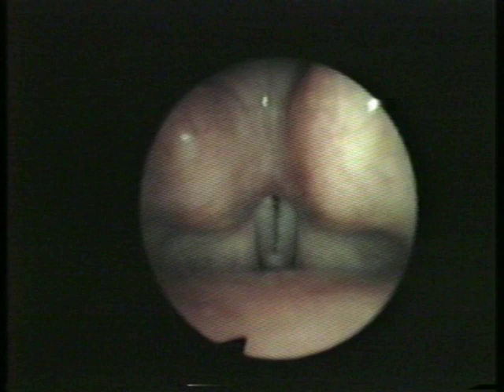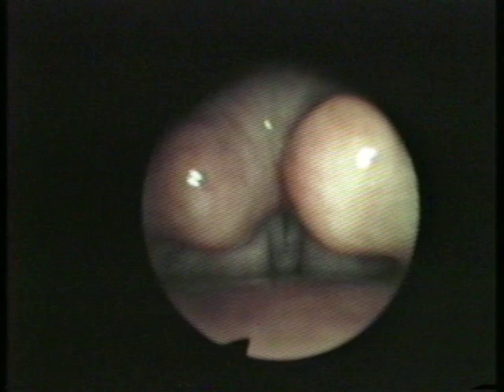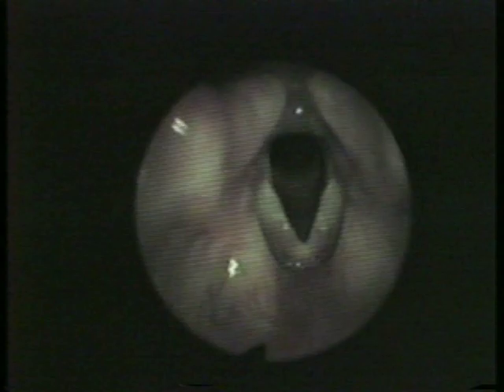See what happens when you sing some low pitches. Do that one again. Great, okay. You're doing great. Swallow again, that's great. Cough for me, just give me a cough. Good. A little mucus that was sitting there on your chords. That's gone. Great.